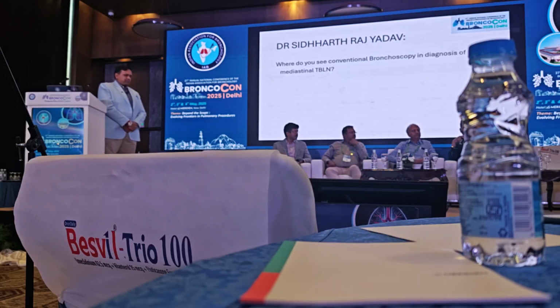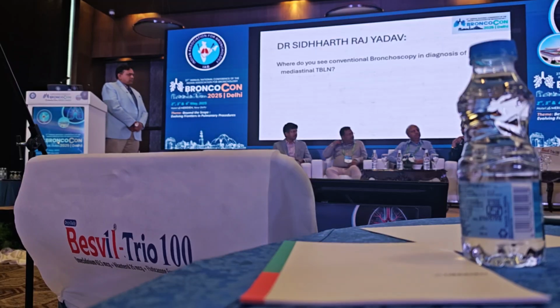So in that case, now with the emerging role of EBUS, which is readily present in our city in Delhi, but if we look at the Indian scenario, the tier 1, tier 2 cities where actually India resides, we don't have all these things. So there is still a role of conventional bronchoscopy and conventional TBNA.